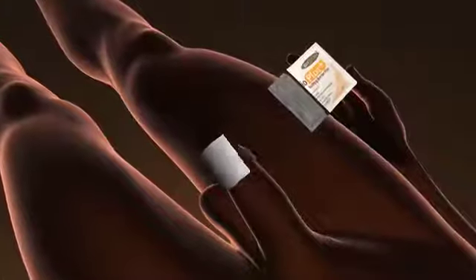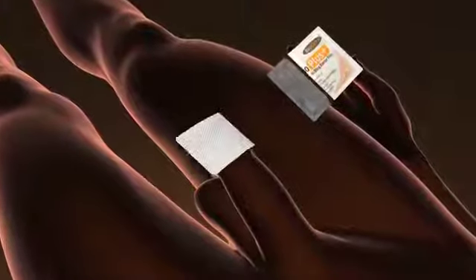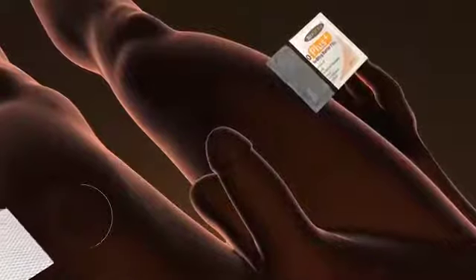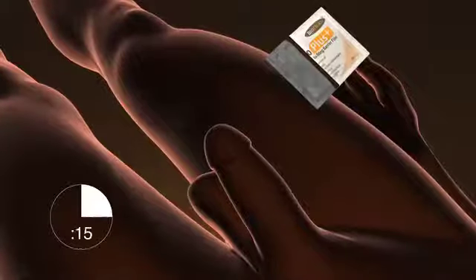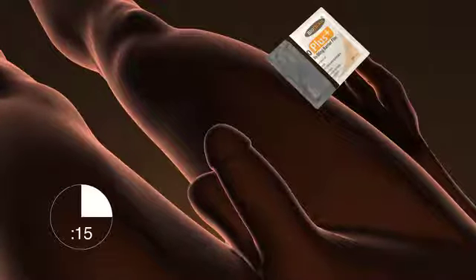Step 2. Use the BioPlus barrier wipe and thoroughly apply to the head of your patient's penis. Let the BioPlus dry until it is no longer sticky, approximately 15 seconds. The BioPlus must be completely dry before the next step. This is very important.